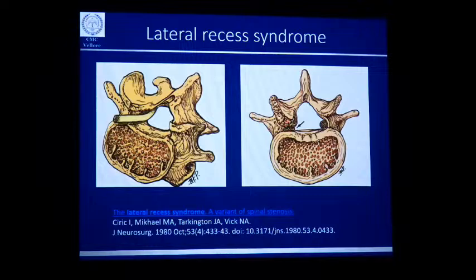So it's always necessary to remove the entire extent of the hypertrophied superior articular facet to decompress this nerve root. Usually the nerve compression is maximum superiorly and laterally. That's where you have to start decompressing and come all the way until the nerve root is exiting the foramen.